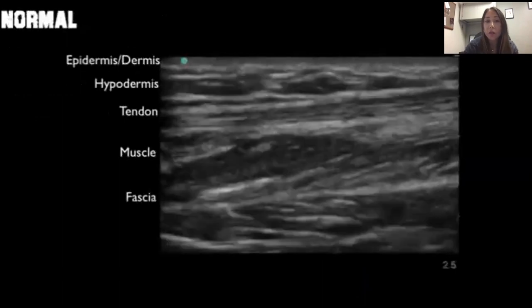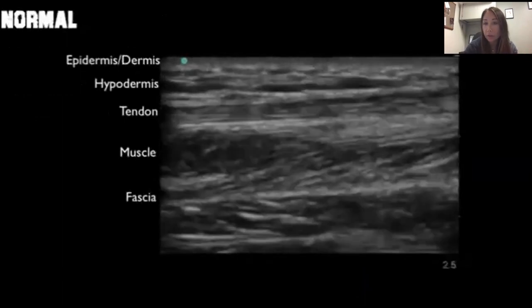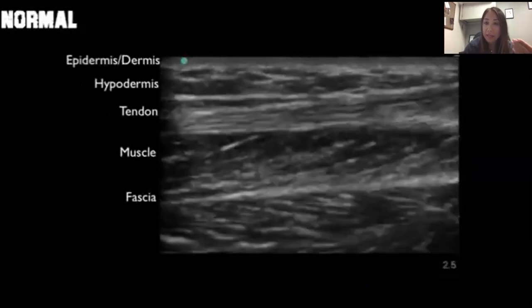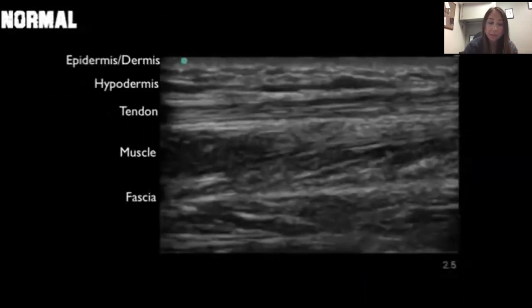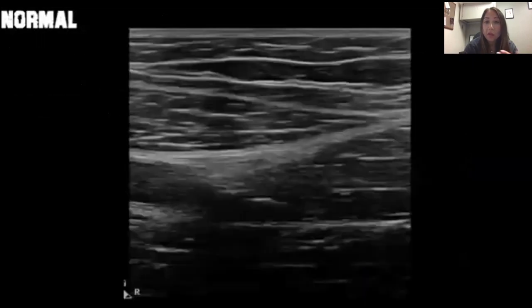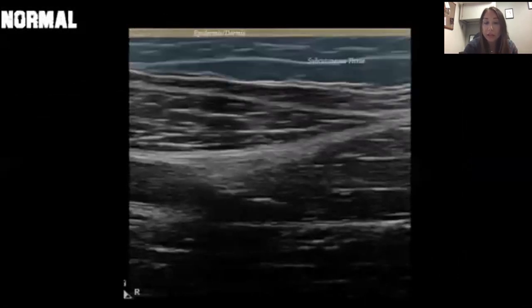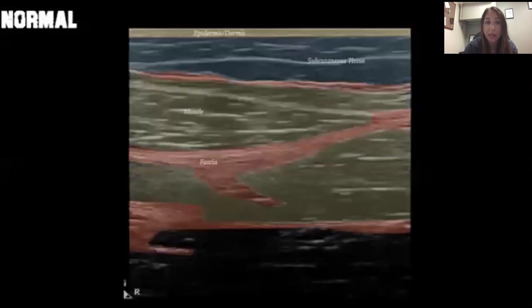When we look at soft tissue, the first layer you'll see is the epidermis and dermis. For normal soft tissue, you'll initially see the epidermis and dermis, then subcutaneous tissue, followed by the fascia layers and muscles.